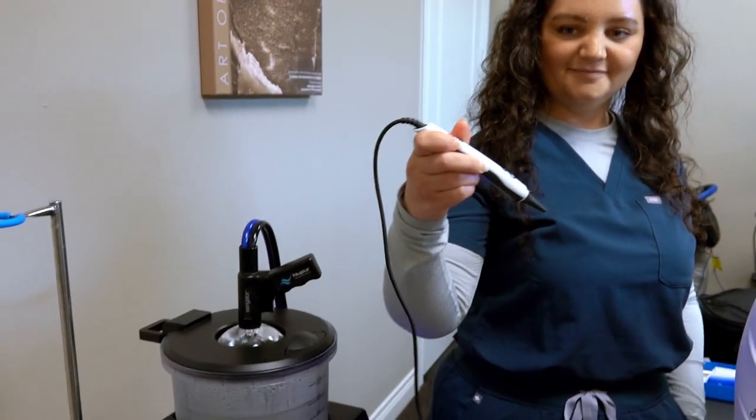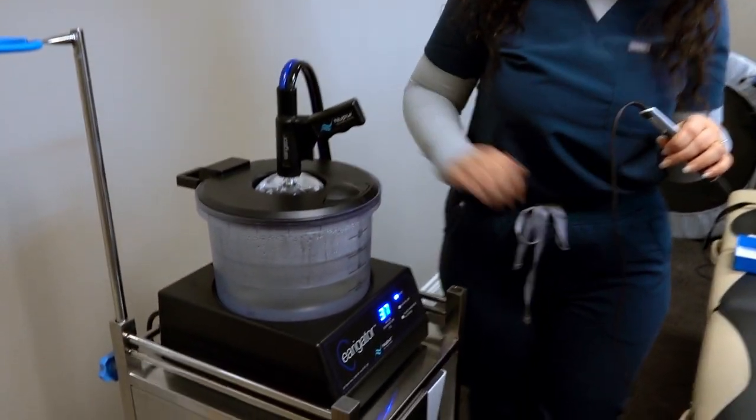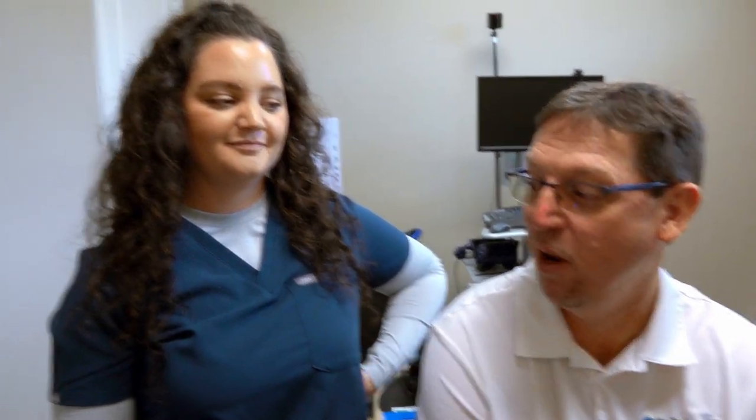Hey guys, getting my ears cleaned out today. I have tons of wax in my ears and it happens all the time. We've got this great piece of equipment called the irrigator and we're going to get my ears flushed out. I'm really excited because I can't hear very well and my ears are really messed up right now. Here we go.